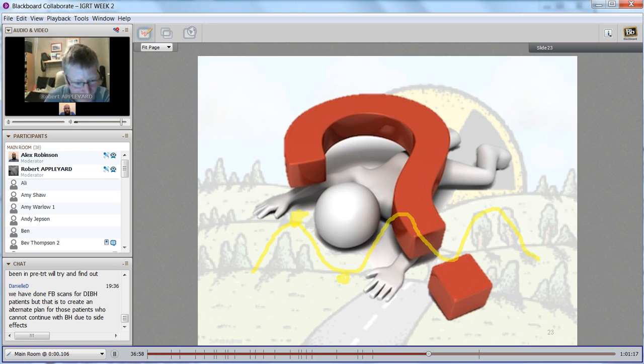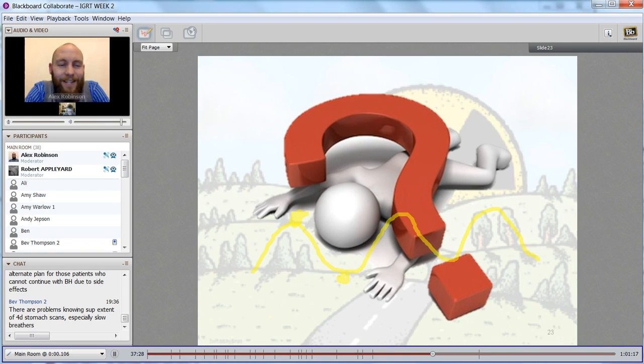No, that sounds good to me. Something I was going to comment on in relation to pitch and breathing is that you can get artifacts, I think, if the tumour motion is fairly similar to the pitch and gantry rotation speed. So artifact is an issue.